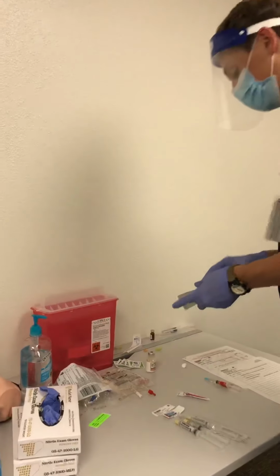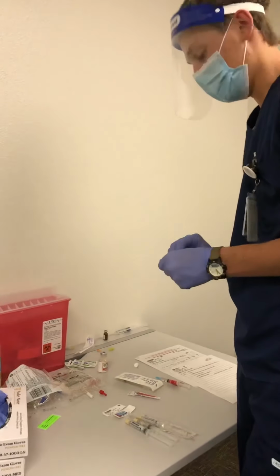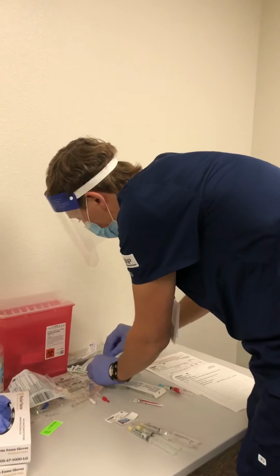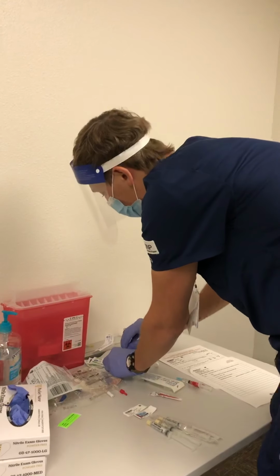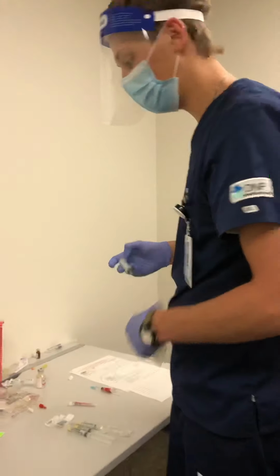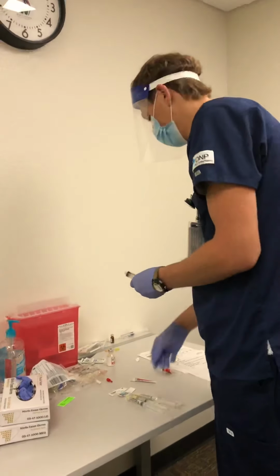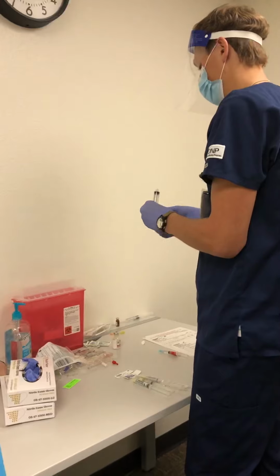So I can go ahead and prepare my syringe right after I clean the medication container. Okay, while that's drying, I'll finish prepping my syringe here. And go ahead and open this one.